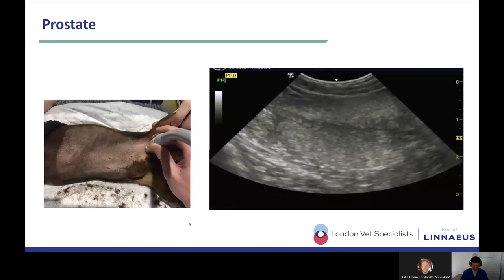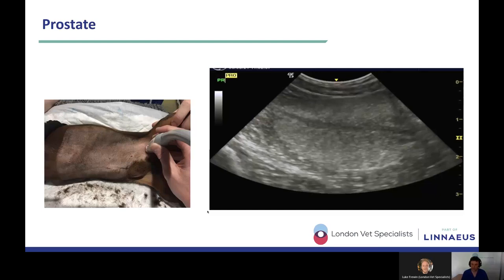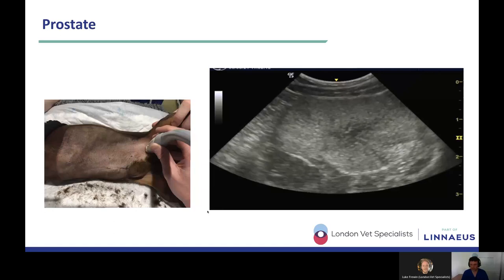And that is our prostate just here. So this is our prostate. That's one of the prostatic lobes here. That's the other prostatic lobe here. This is the urethra going right the way through the middle of that prostate. That's a nice normal prostate. It's symmetrical, it's got a uniform echogenicity, and we can see both of the lobes are exactly the same size. The prostatic urethra looks absolutely normal. It's a very happy looking prostate.